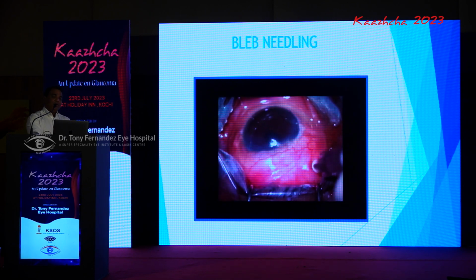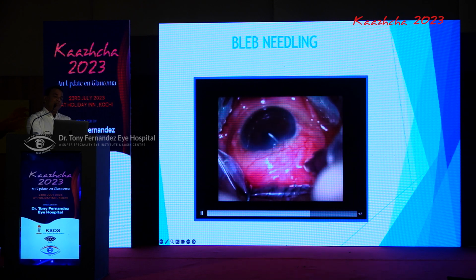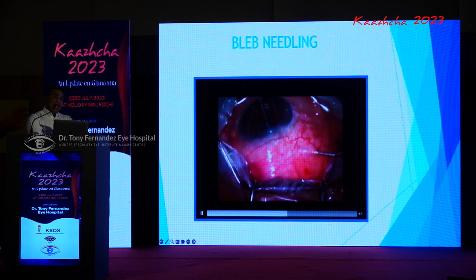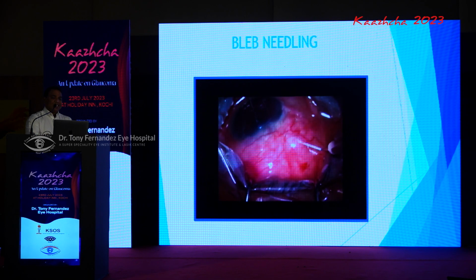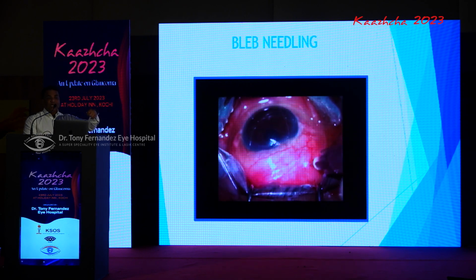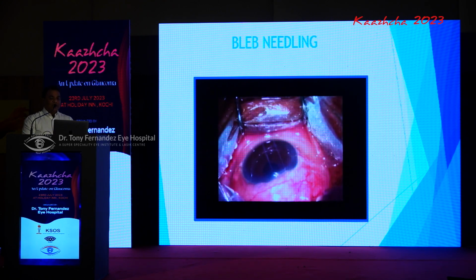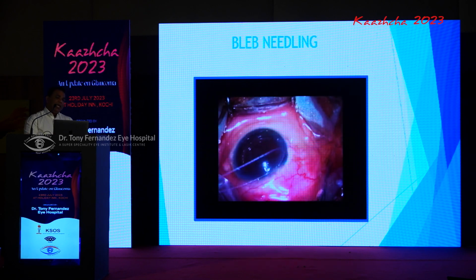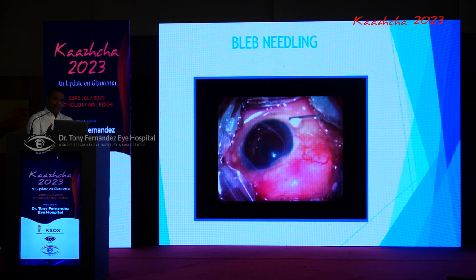So I will forward it here. Here I am trying to find out where my flap is. First remove this subconjunctival fibrosis and slit this needle under the flap. Just elevate the flap, and this is the moment when you go under the flap, the traction you have becomes loosened. So you have entered into the anterior chamber. Once you enter the anterior chamber, you can feel the fluid gushing out from the eye, and you make the side port, and you re-form the anterior chamber.